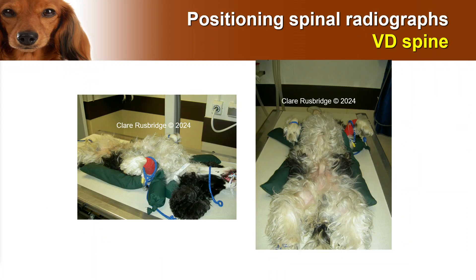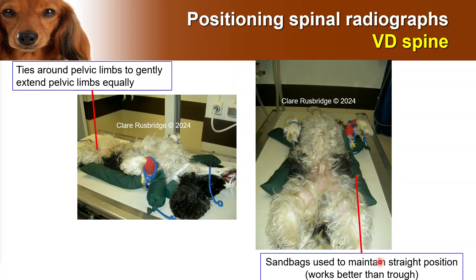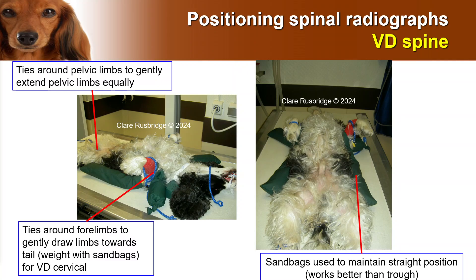When positioning for the ventrodorsal spine, it's very similar to the cervical imaging. We want to make sure that the chest down to the pelvis is straight. I try to get the forelimbs out of the way — these limbs aren't actually tied here, they just have the ties on from previous imaging — with sandbags over there and others to support. We have the wedging underneath the neck to make sure it isn't flopping down and pulling on the thorax. I extend the pelvic limbs gently using ties and then use these sandbags, which in my opinion works much, much better than a trough, and then I don't have to lift dogs in and out of a trough either.